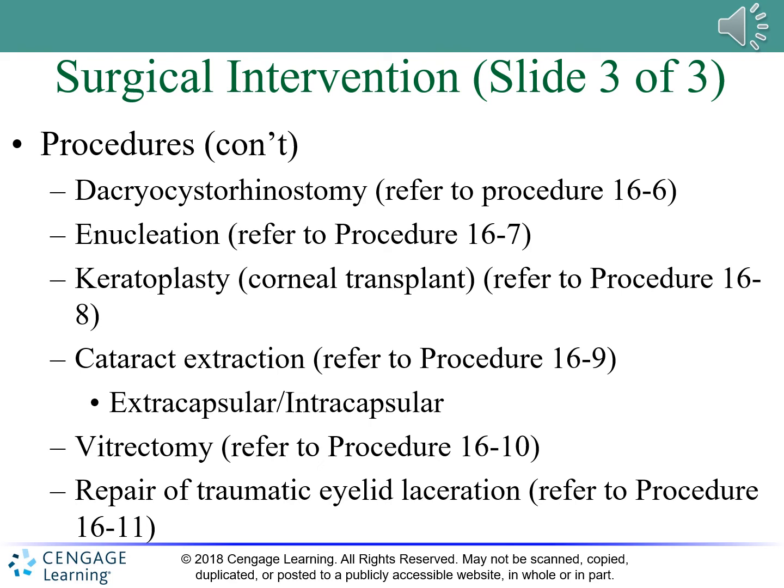All right, so on the next page, the surgical procedure number 6, I'm just having you underline that phacoemulsification handpiece. So there is a handpiece that you use to dissolve that lens. Number 7, the viscoelastic is injected to re-inflate the capsule. So I'm just showing you where that's being used. And you can see what's going on 617.